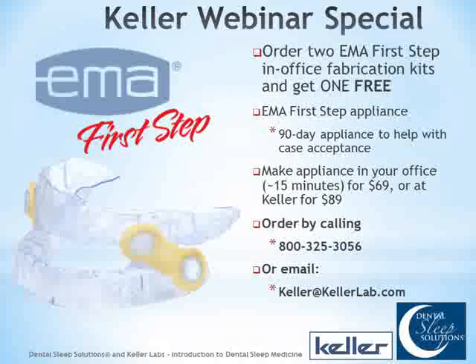The plastic that they make it out of, the suck-down material, is 0.03 instead of the 2.5 mil, so it doesn't last as long, but it's a less expensive way to handle a patient who's sitting on the fence and you just can't get them to commit to making a full device. Then you can try this.